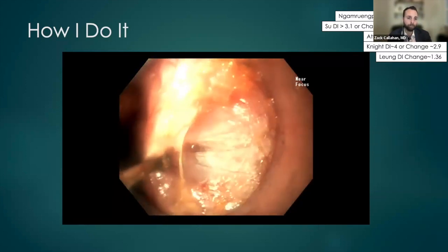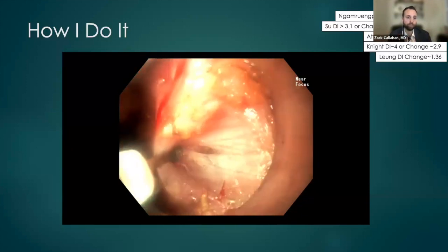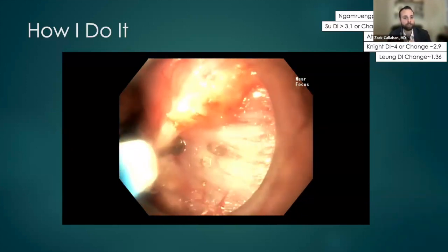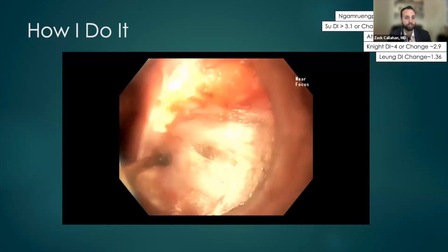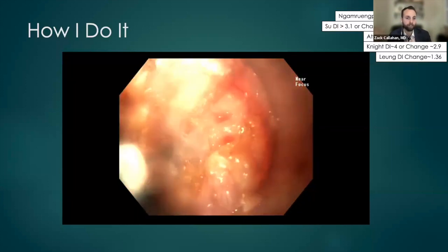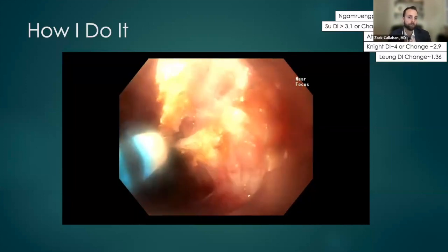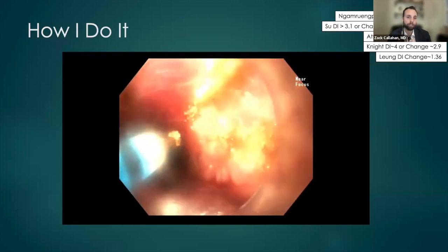And I don't think there's any right or wrong way to do this. Certainly cutting the muscle from screen right to screen left is fine. It's kind of nice. You can see it hooks that circular muscle up, and pushes the longitudinal muscle back. But the trick with this one is, if you're putting too much tension going that direction, you could accidentally overshoot it and burn your mucosal tunnel, or the protective mucosa of your submucosal tunnel.